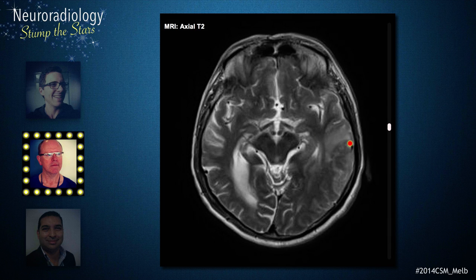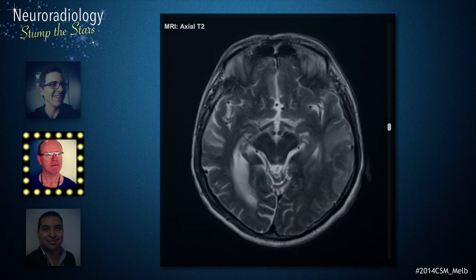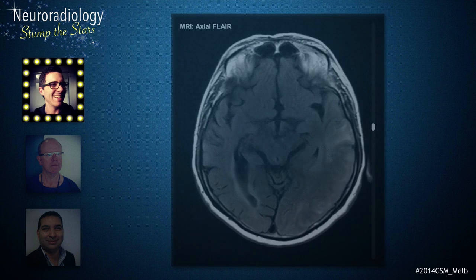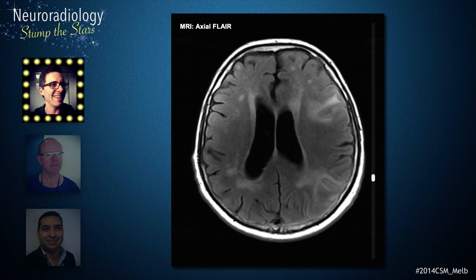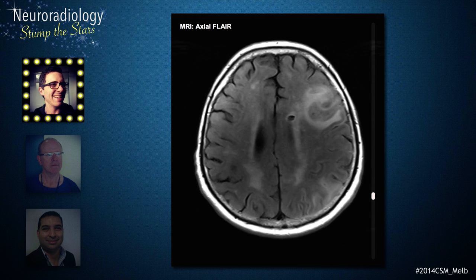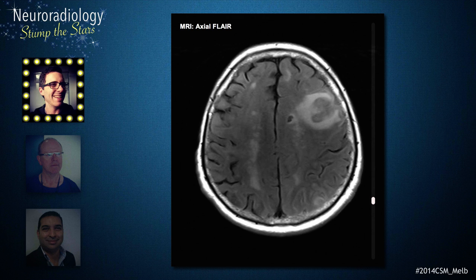These consist of T2 signal abnormality in the white matter, extending into the overlying grey matter. On FLAIR, there is widespread high T2 signal with a relatively circumscribed region with some positive mass effect involving the left frontal lobe. This involves Broca's area, accounting for the patient's expressive dysphasia.